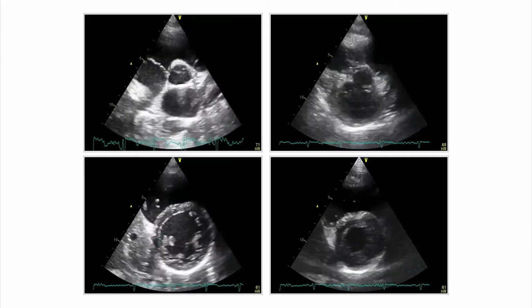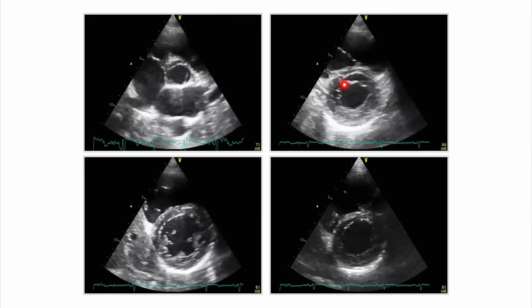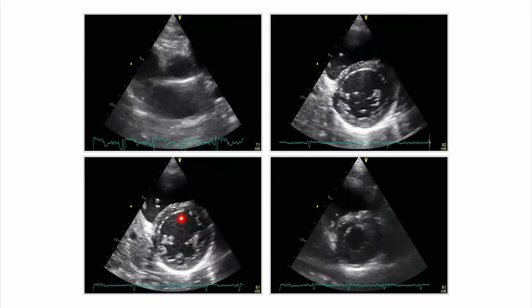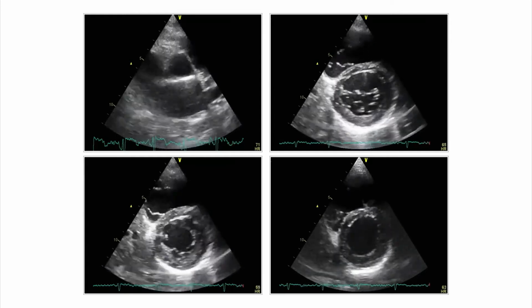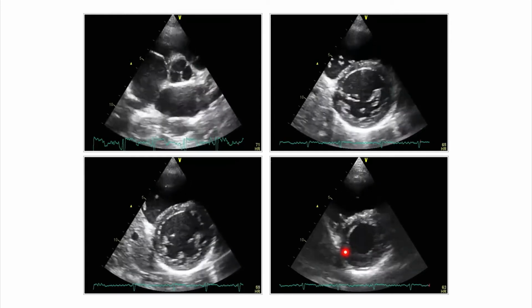Then further down, we are imaging at the level of the mitral valve. This is the fish mouth of the mitral valve. Here we are at the level of the ventricles between the mitral valve and the papillary muscles. We see still some chordal structures here. And then finally, this is only the ventricle. Here are still some parts of the papillary muscle visible. So different levels in our tilt and different images.